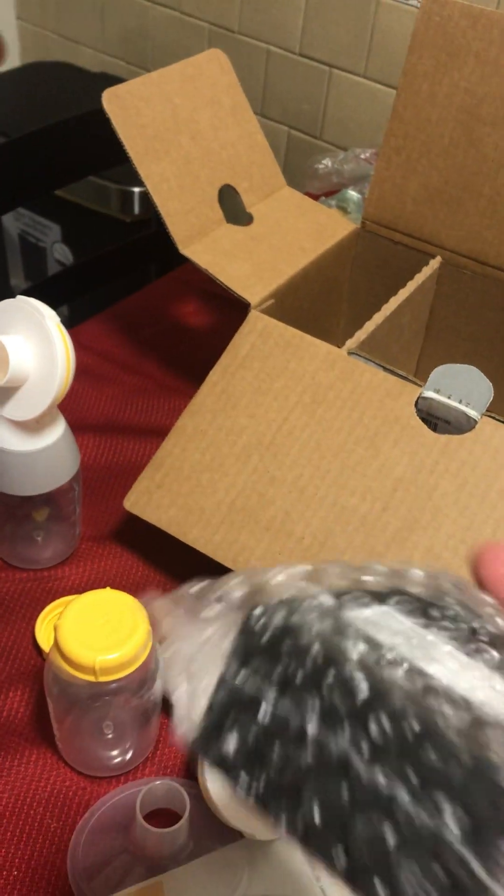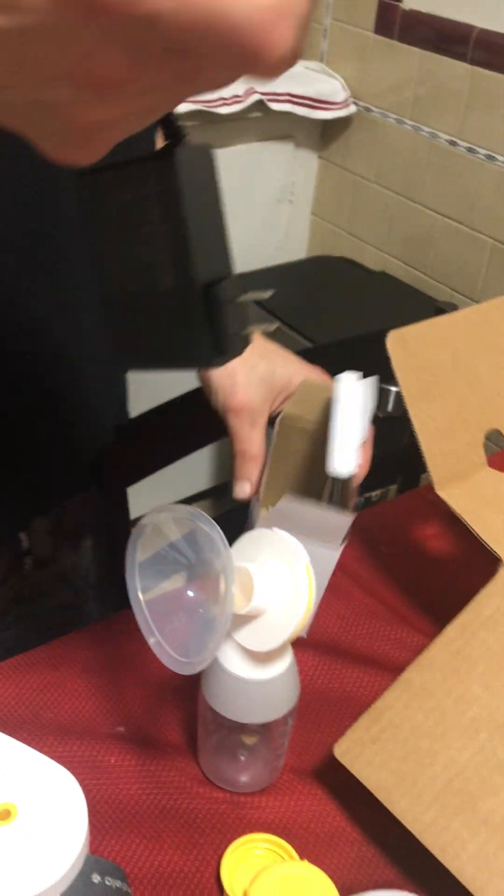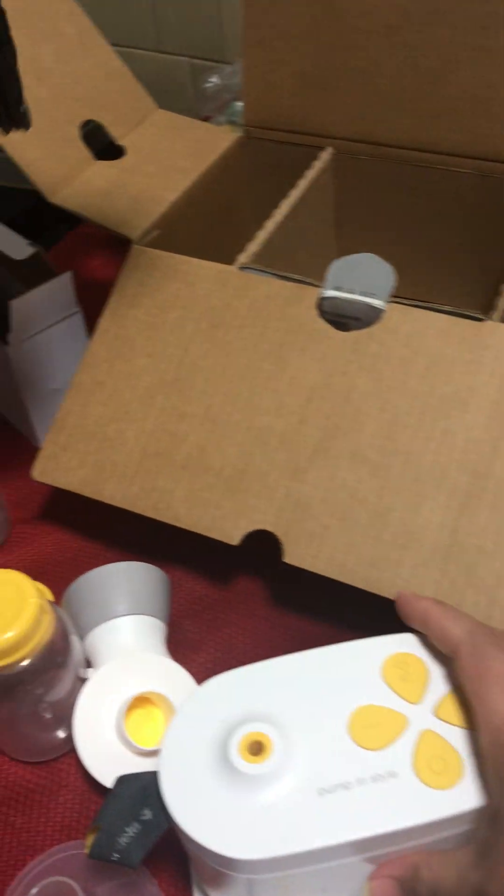This one's the power cord. This one's the wire because it's electric. Then this one is the main machine.